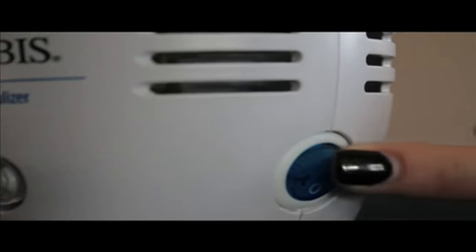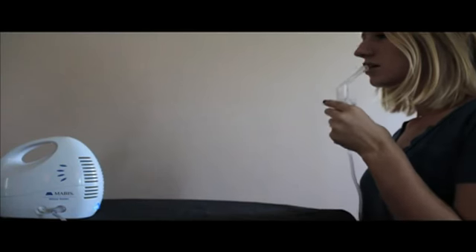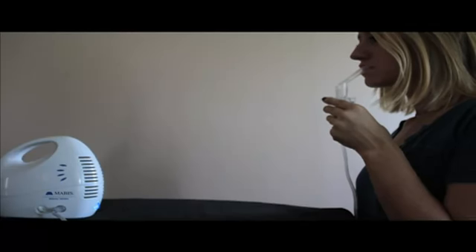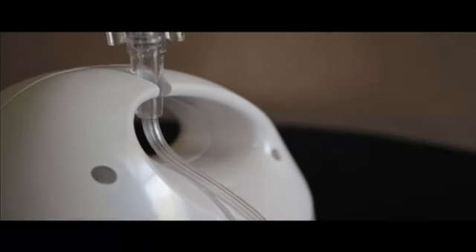Press the power button to the on position. Hold the nebulizer in your hand and start your treatments according to your physician's or therapist's instructions. There is a groove on the handle of the nebulizer that can be used to help with treatments.